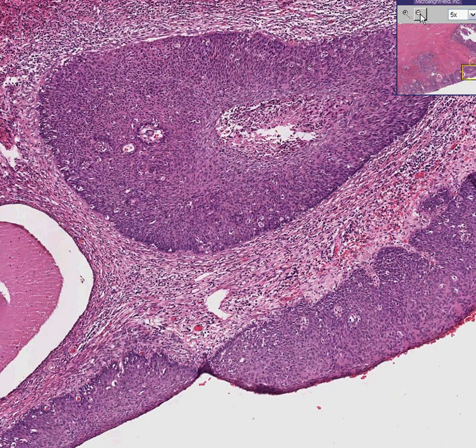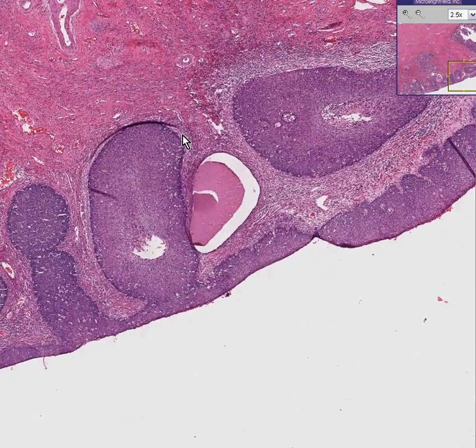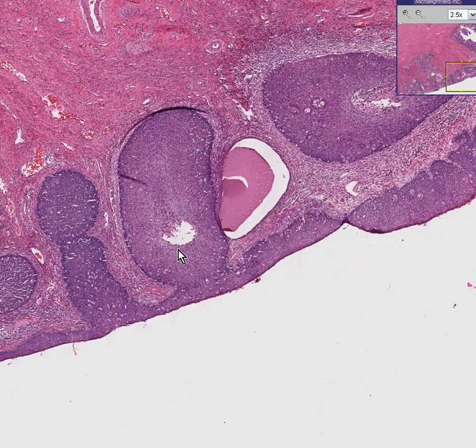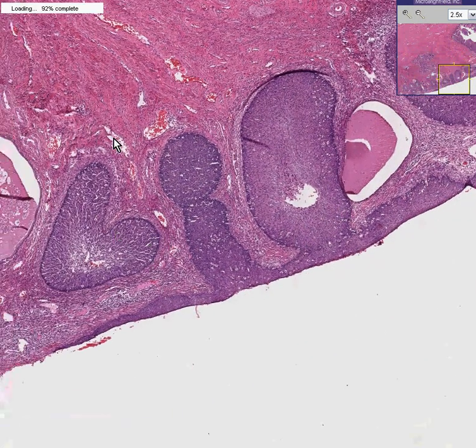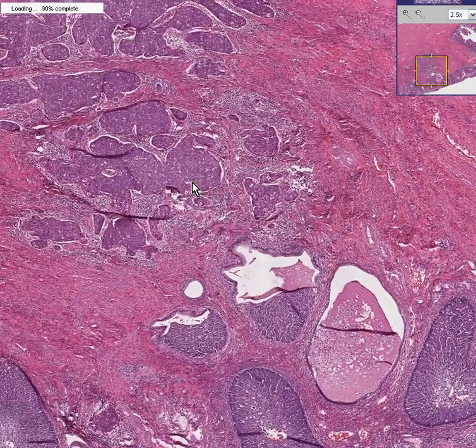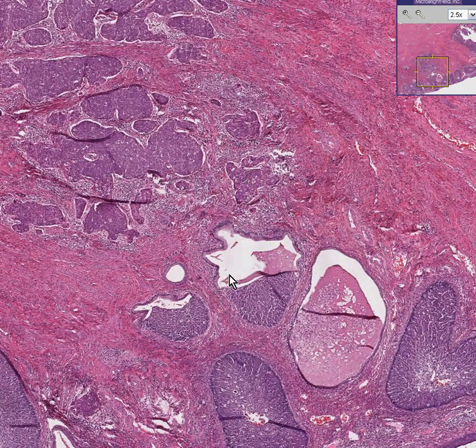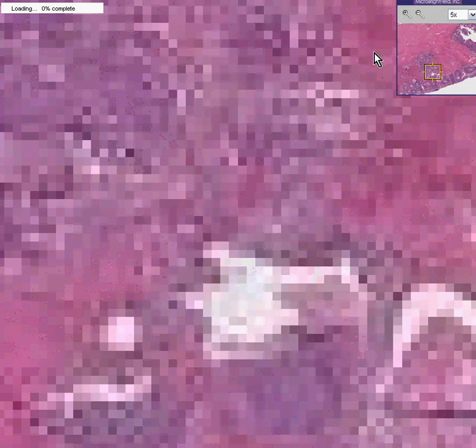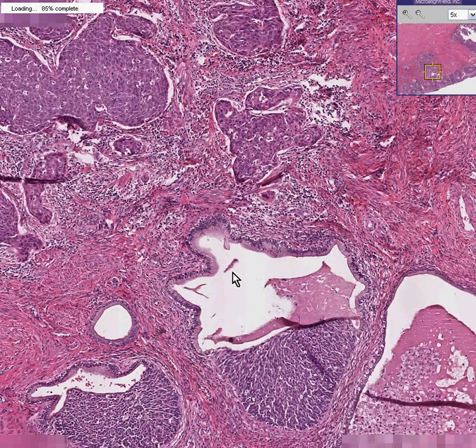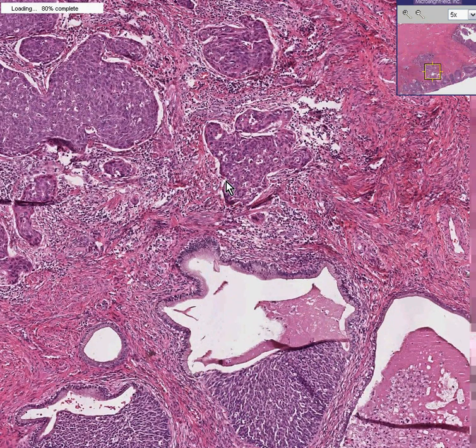But there's an extremely important differentiation to be made here. Whereas you know that these are endocervical glands, because like these normal endocervical glands, they seem to be right underneath the mucosa. Please note, as we travel along, there are areas of tumor that do not appear to be nicely contained within these endocervical glands. Here's an endocervical gland lined by columnar epithelium, but it has carcinoma in situ within it.